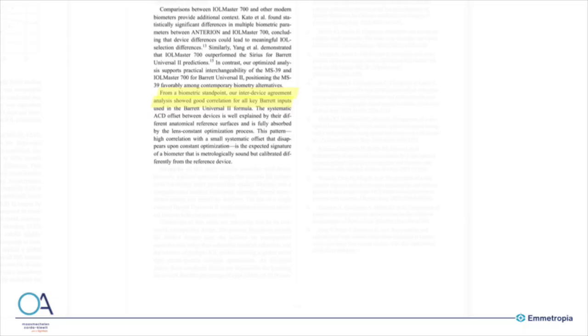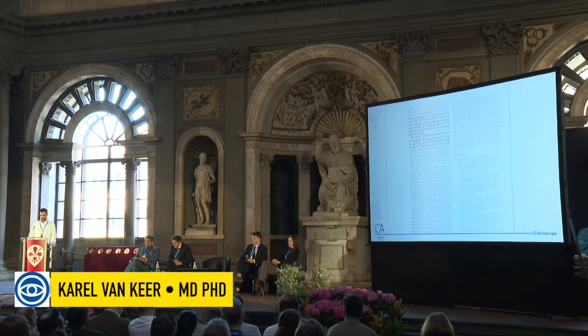So in conclusion, there is no clinically significant difference in predicting the IOL power between the IOLMaster 700 and the MS-39 in routine cataract cases.